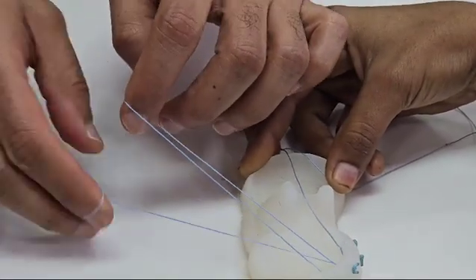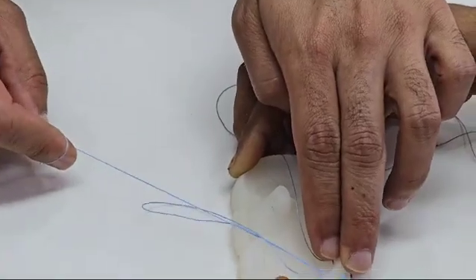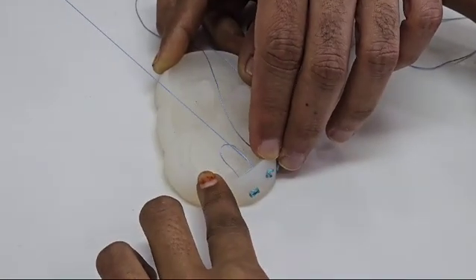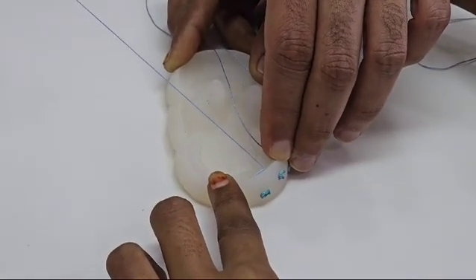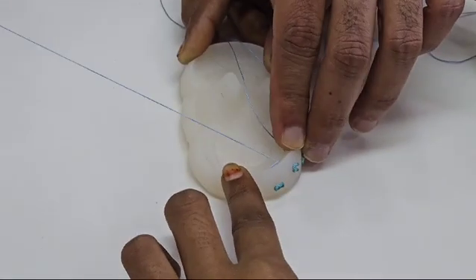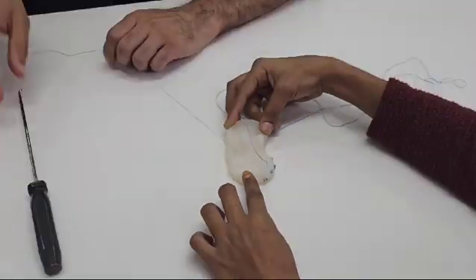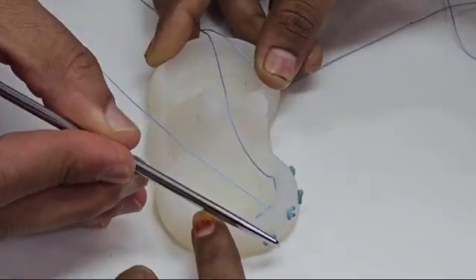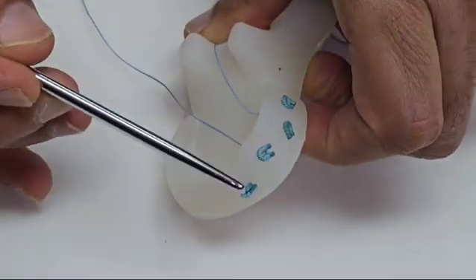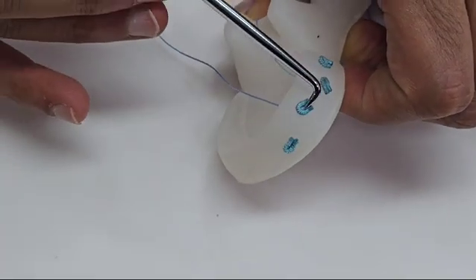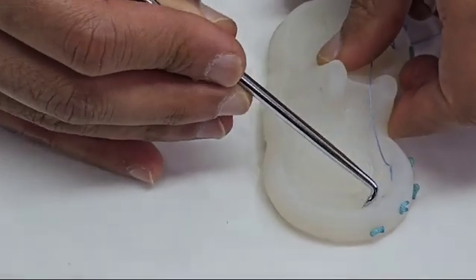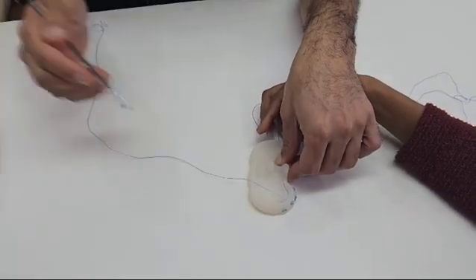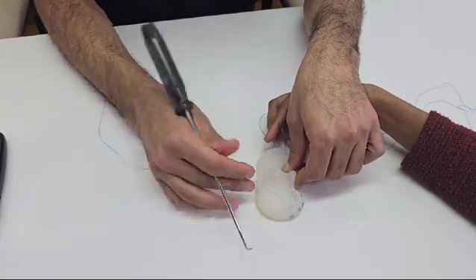When we do that, both the loops will be tensioned properly, and this is the way the meniscus repair will look. Here you will see a very good meniscus repair - both the anchors are Omega-shaped here, the knot is on the back, there is nothing on the meniscus side. When we tension this implant, there is nothing on the joint side.